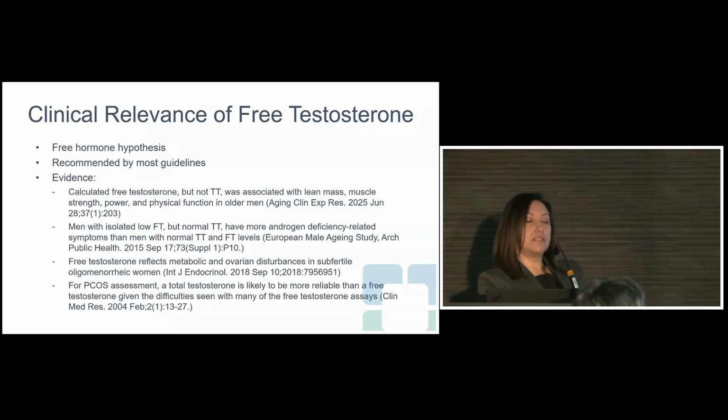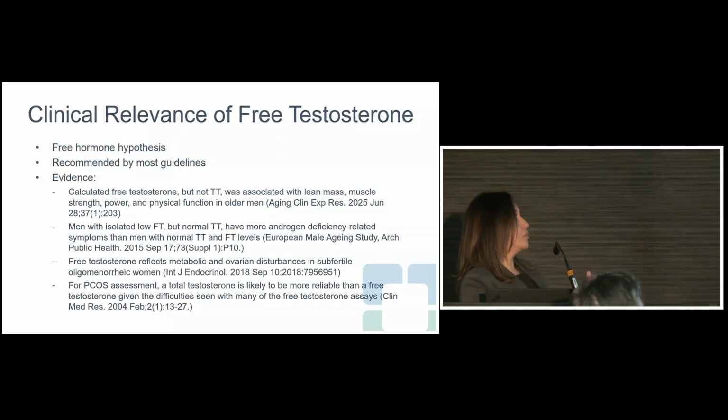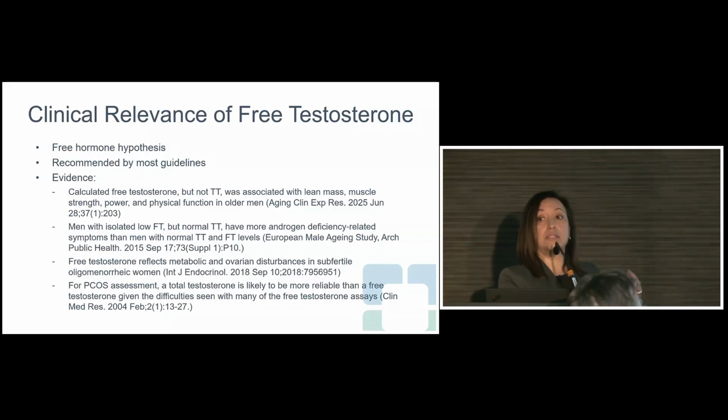The clinical relevance of testosterone is somewhat well understood and established, and also somewhat controversial and not well understood. Starting with the free hormone hypothesis, which postulates that the free active form of a hormone is the one that has the biological activity, because it can go into the cells, whereas the bound forms cannot.